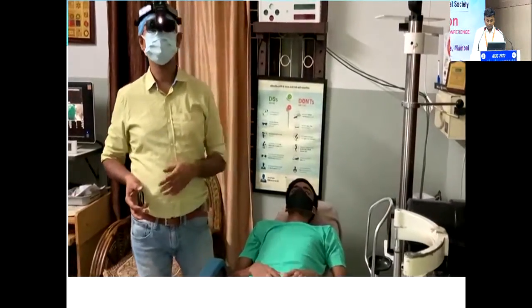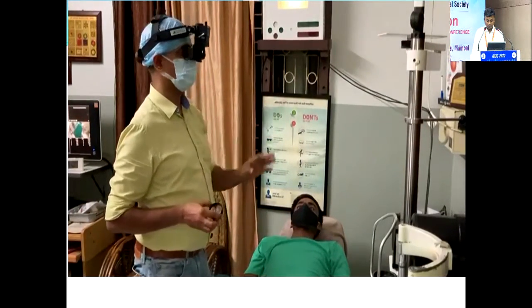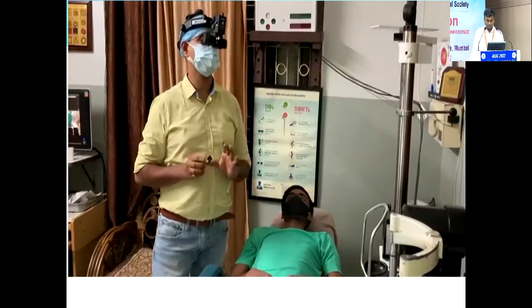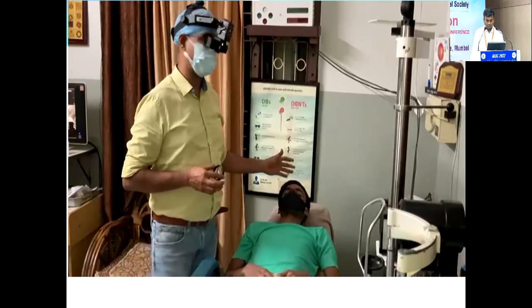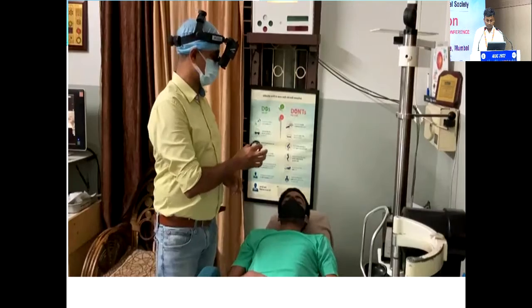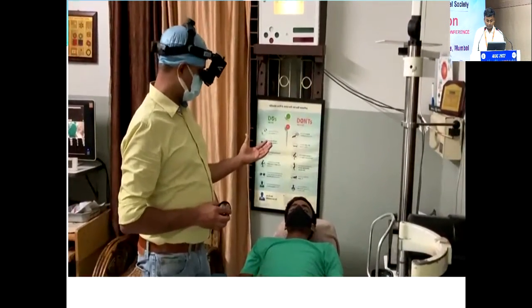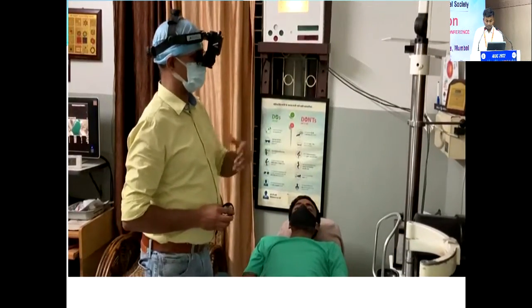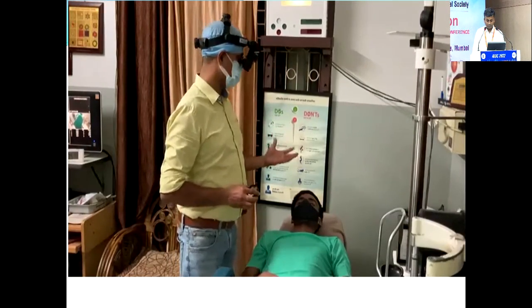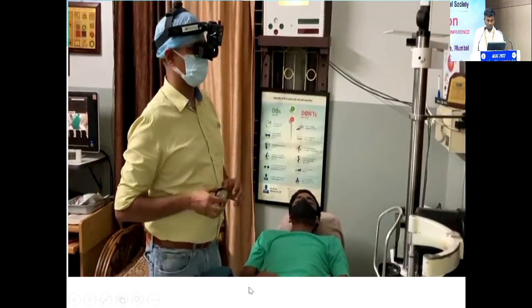So now, before starting the procedure and demonstrating how you do the indirect ophthalmoscopy, I'll just briefly go through the optics of this. The whole concept of the indirect ophthalmoscope is you have to make the eye myopic by placing a high powered convex lens, that is the condensing lens, in front of the patient's eye, and this results in seeing a fundus image which is real and inverted. Since it is the indirect viewing of the fundus through the condensing lens, we call it indirect ophthalmoscopy.